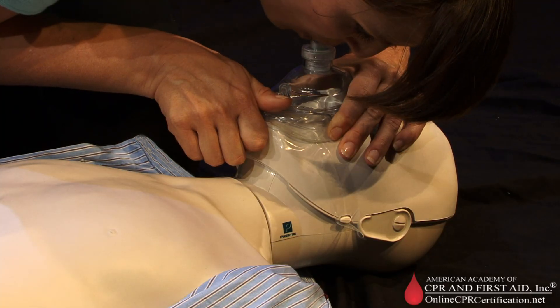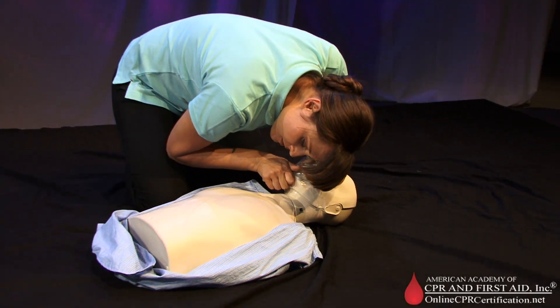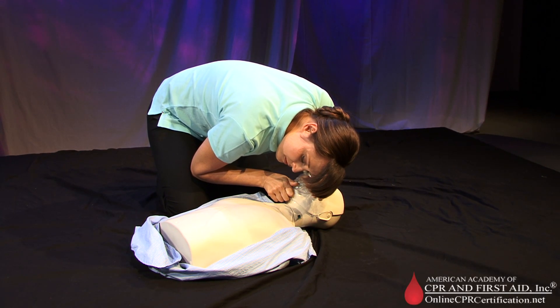Give two breaths. Deliver air over one second to make the victim's chest rise. For adults, give one breath every five to six seconds for a rate of 10 to 12 breaths per minute.